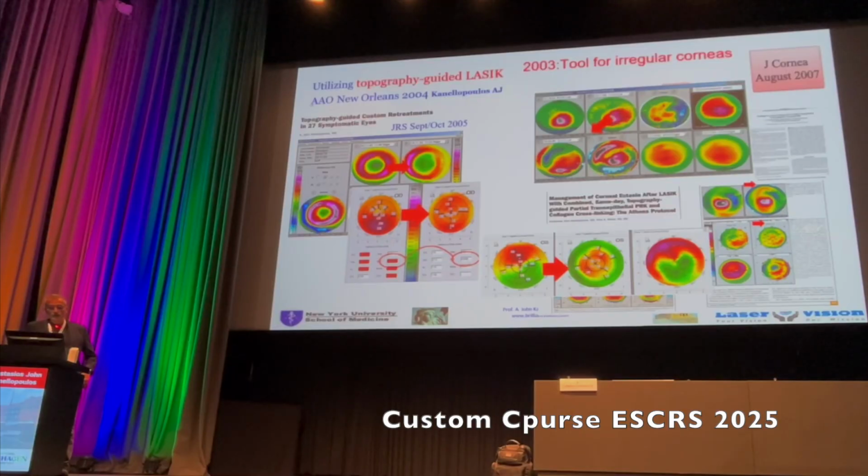This was a broad beam laser case that had a very small optical zone. I mean, no lasers anymore produce such small optical zones, and the patient had significant night vision problems because he had a 7mm pupil. So of course I said, don't worry about it, we'll fix it. I have this new technology that can broaden the optical zone. And that's what we did. We imaged that cornea, we broadened the optical zone. Was the patient happy afterwards? He was 20/20 here. After I broadened the optical zone, he ended up being 20/50.